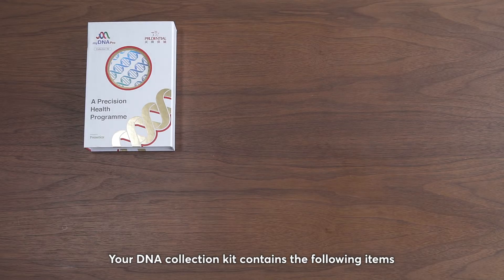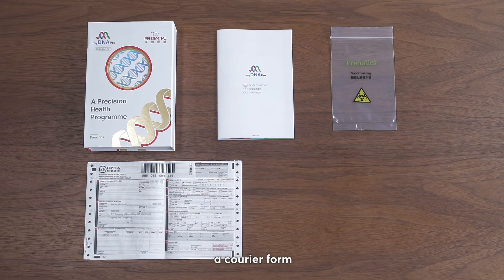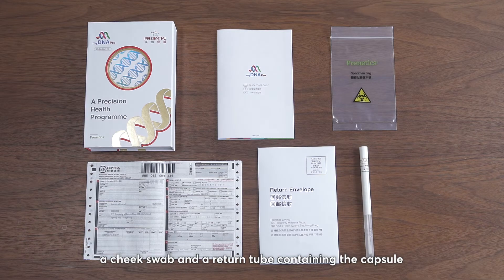Your DNA Collection Kit contains the following items: a quick start guide, a specimen bag, a courier form, a return envelope, a cheek swab, and a return tube containing the capsule.